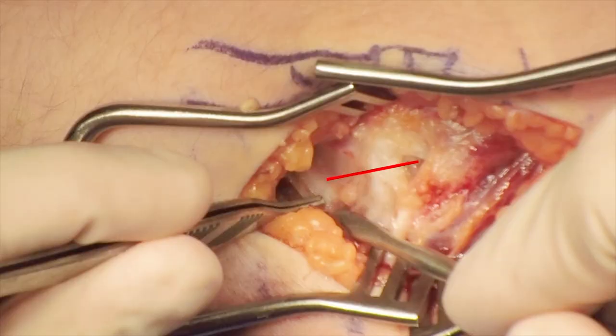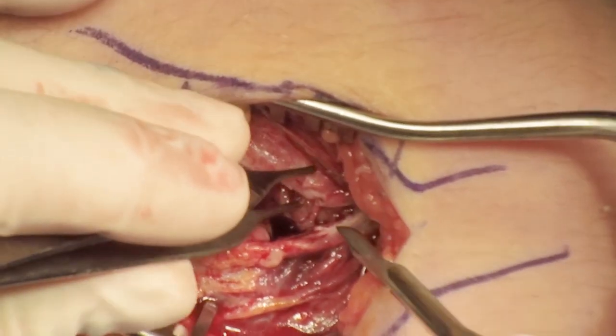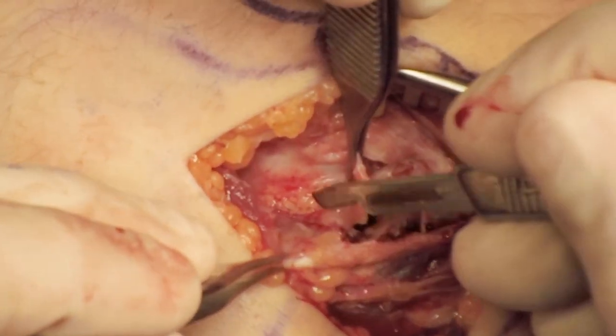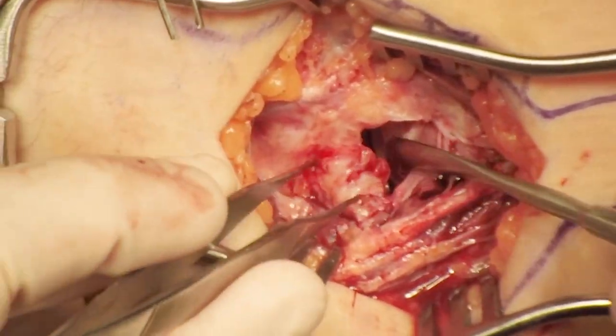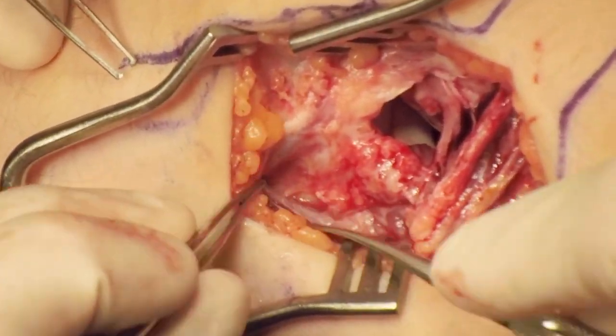The lateral collateral ligament can be seen running from the lateral epicondyle distally and posteriorly to the crest. The tear can be seen more proximally at the insertion of the LCL on the epicondyle. A capsulotomy was performed. The extensors were elevated off the epicondyle more proximally — there was near complete avulsion of the extensors off the epicondyle. The forceps can be seen holding the lateral collateral. Subperiosteal dissection of the ulna is performed in order to better visualize the insertion of the LCL.